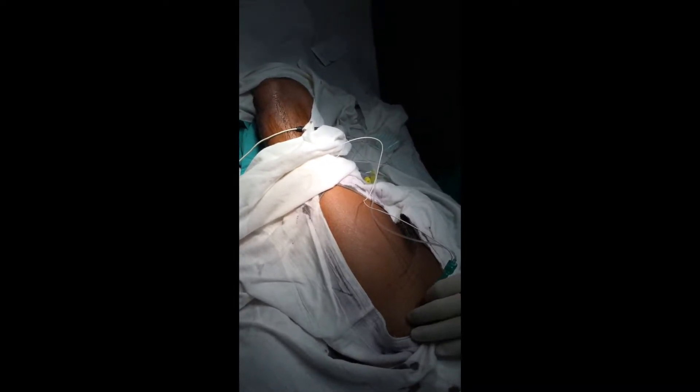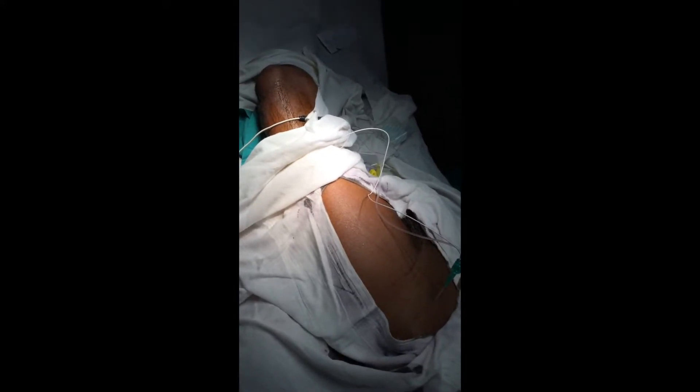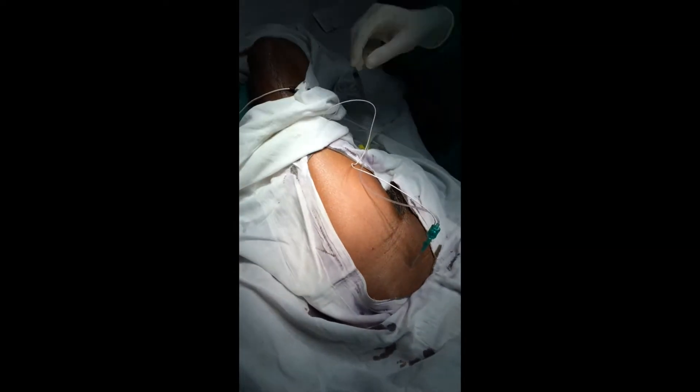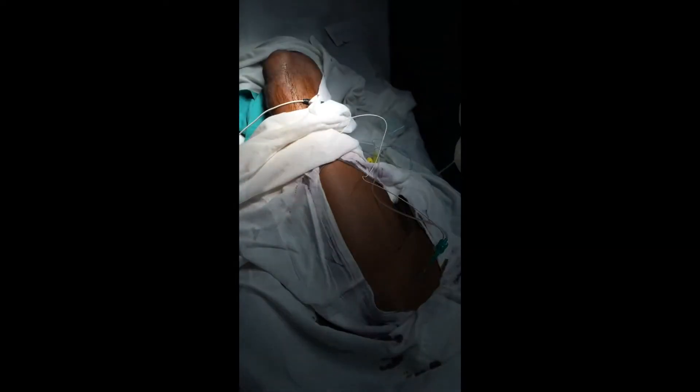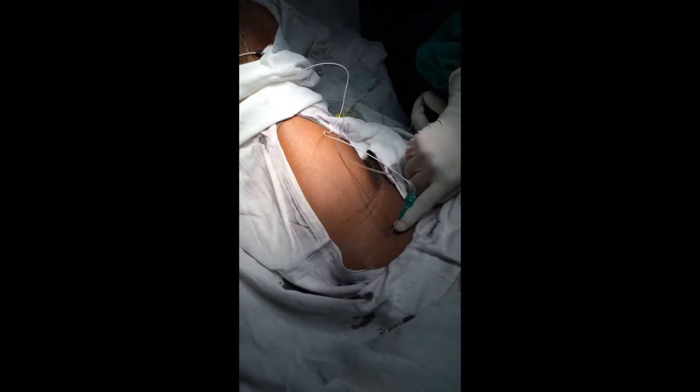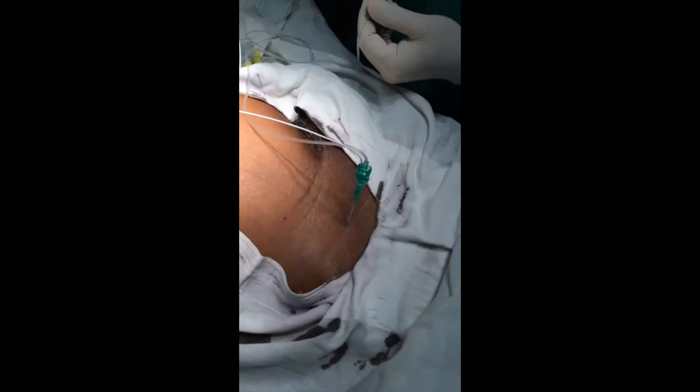Decreasing the current further from 0.6 milliamp, but unfortunately getting twitches at 0.2 milliamp, so I'm slightly withdrawing the needle and increasing the current to get twitches at 0.4 milliamp. Now getting twitches at 0.4 milliamp, meaning the needle is very close to the nerve — at around 2.5 centimeters from the skin I am localizing the femoral nerve.